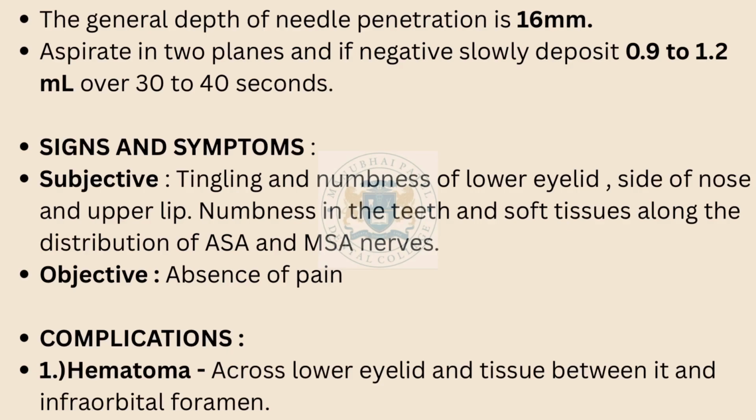The general depth of needle penetration is 16 mm. Aspirate in two planes and if negative, slowly deposit 0.9 to 1.2 ml over 30 to 40 seconds.